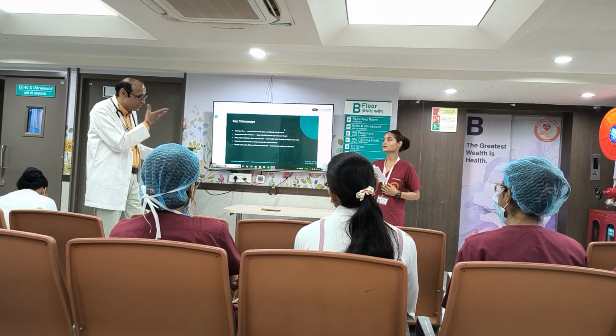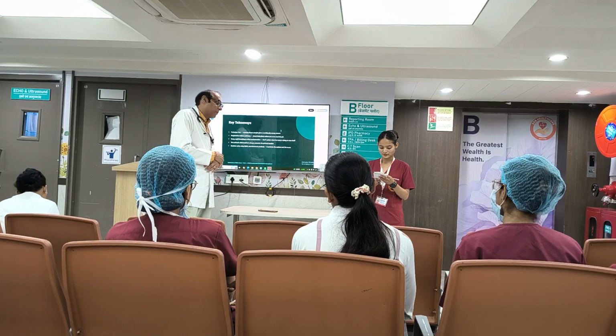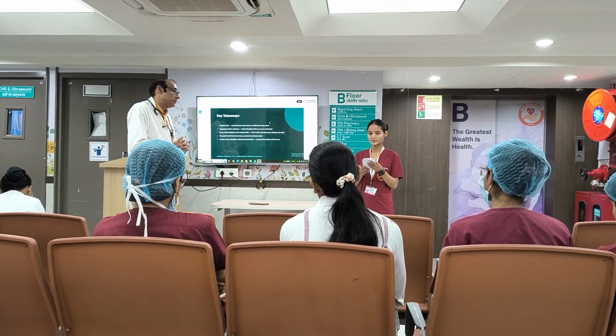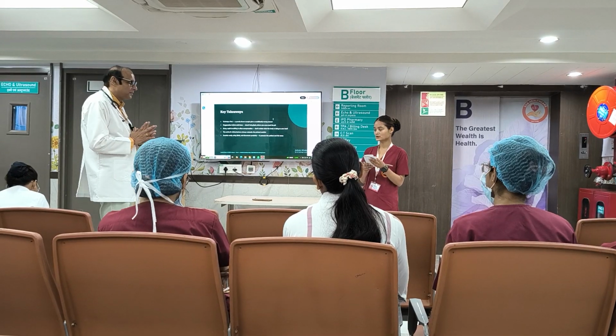It is normal. Normal is 7.35 to 7.45. It is normal, right? Now PCO2, pressure of carbon dioxide, is 36 mmHg. The normal value is 35 to 45 mmHg. It is normal, right?